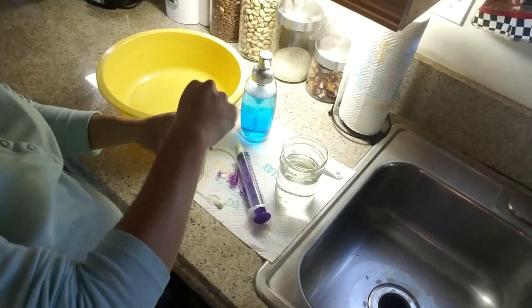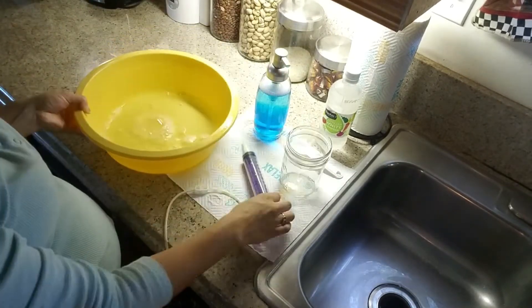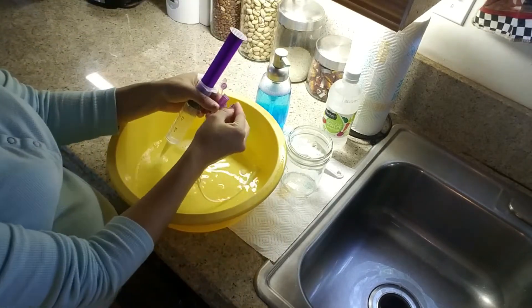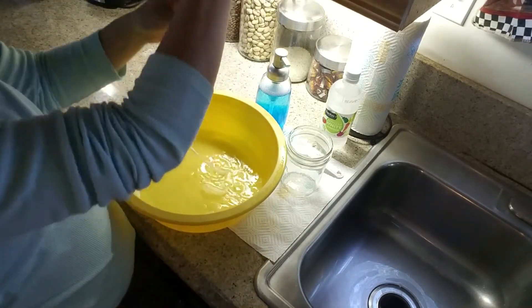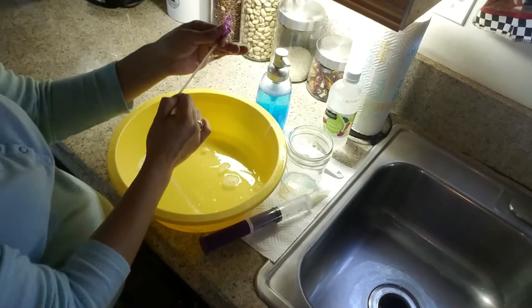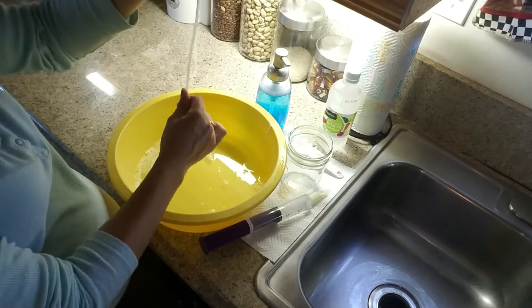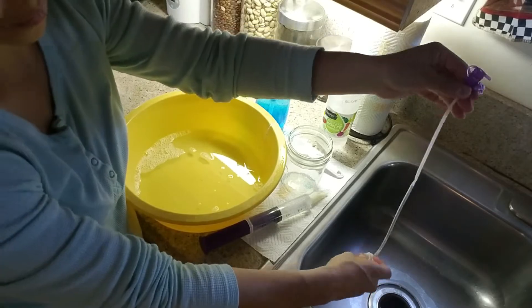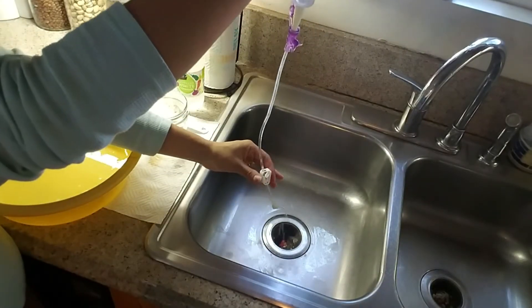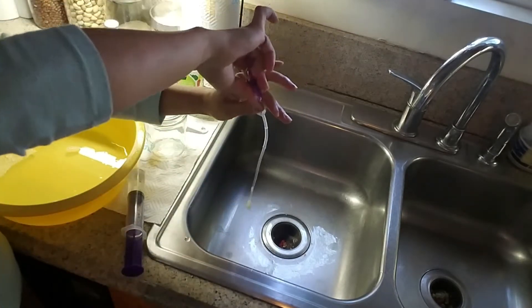I start with one tablespoon of white vinegar, then add just a drop of Dawn dish soap, and pour in two cups of water. Do a little mix, then take the syringe and fill it with the mixture. Fill the extension with the mixture, then use the clip to keep the mixture in the extension. With the clip still clamped closed, pull it up and down the extension — this helps scrape the gunk off the sides. You can repeat this step as many times as you need; I like to do it until the extension is clear and no longer cloudy.